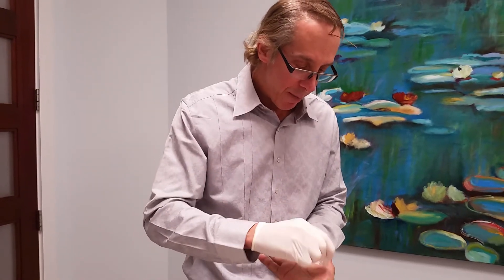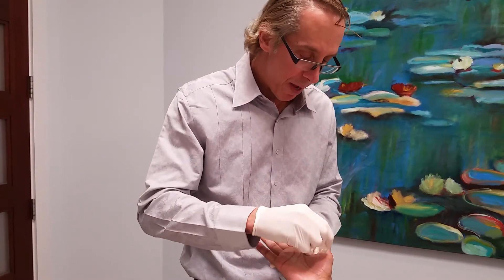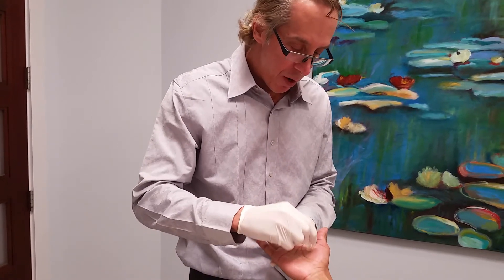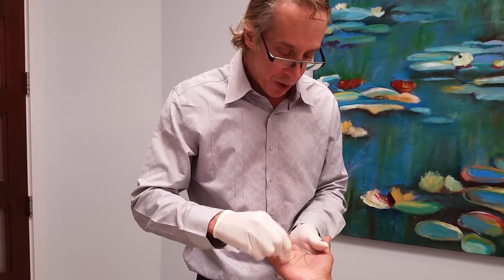Dr. Weiner here showing you a new way to treat hyperhidrosis of the hand. It's using a micro dysport or Botox technique using this device, and it injects very small amounts of dysport into the dermis for a more uniform treatment than using needles, and it's more comfortable.